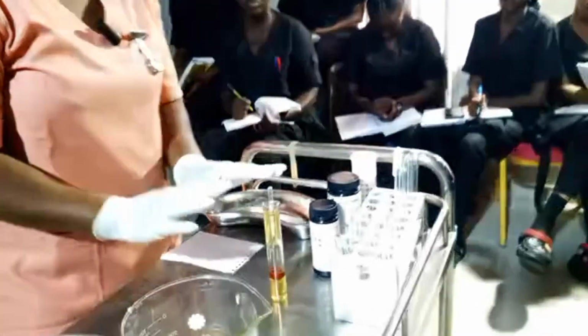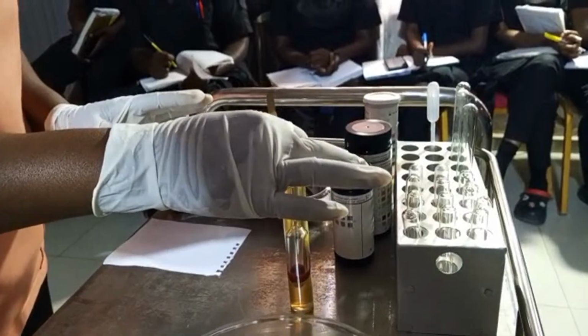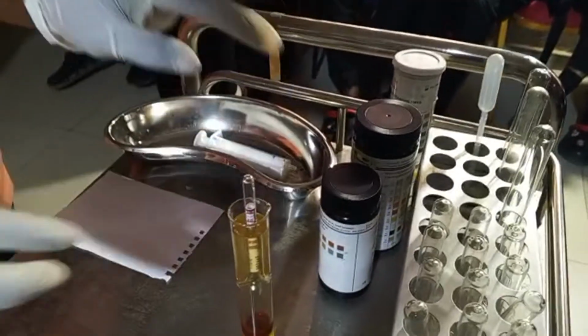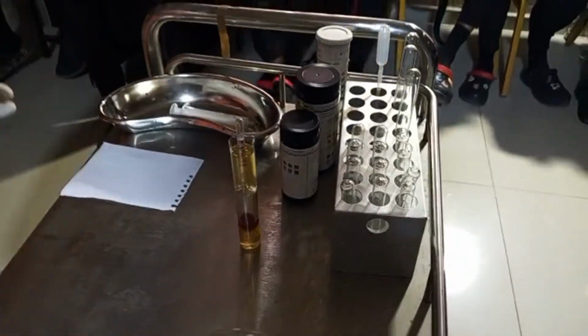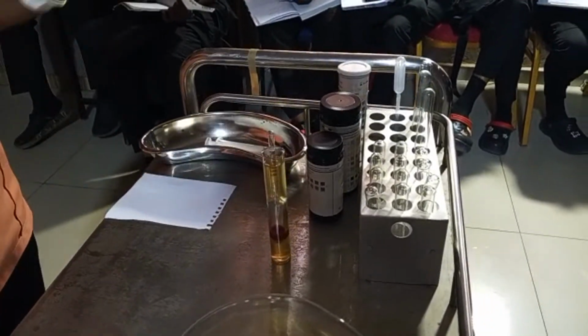See, it is floating. It's not touching the test tube. Look at it. It's floating in the middle, right? So you note, do not shake it. Always make sure that it is standing.